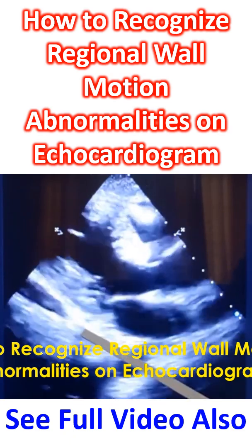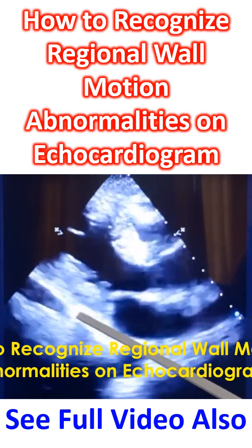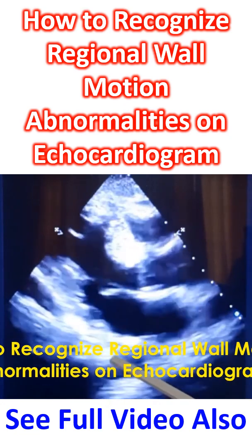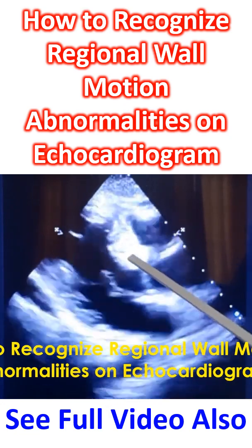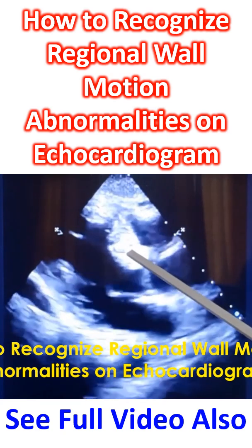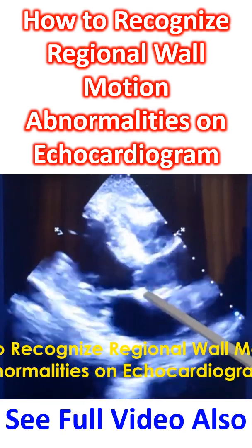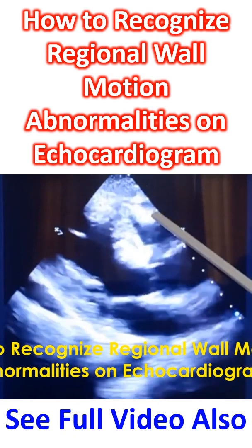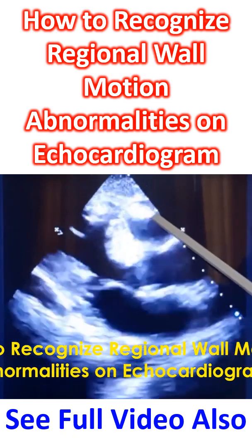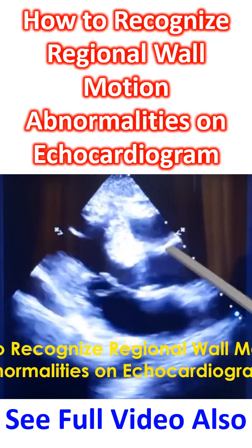The posterior wall of the left ventricle is contracting vigorously, and the base of the interventricular septum is also contracting well. The free wall of the right ventricle is also contracting vigorously. These are normal regions.